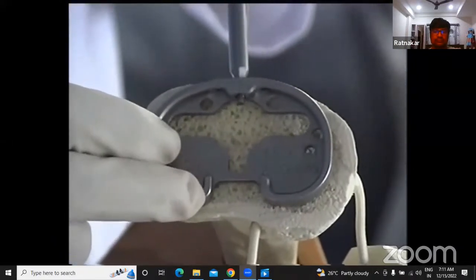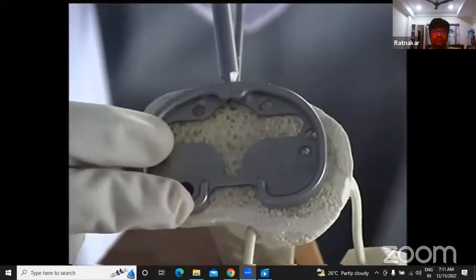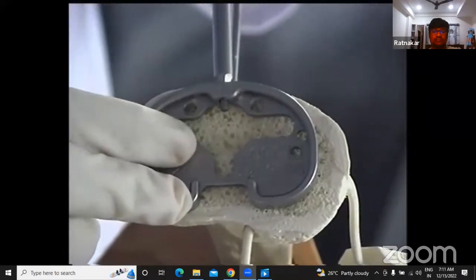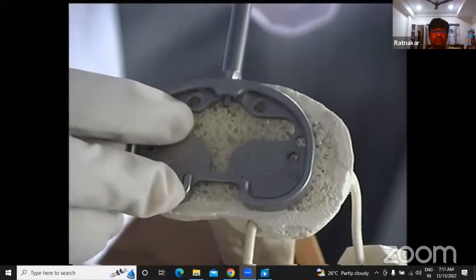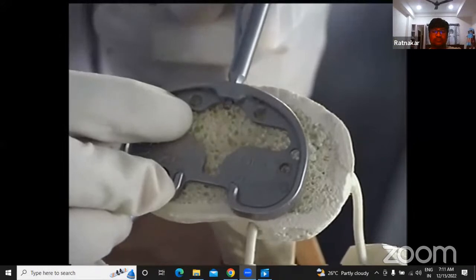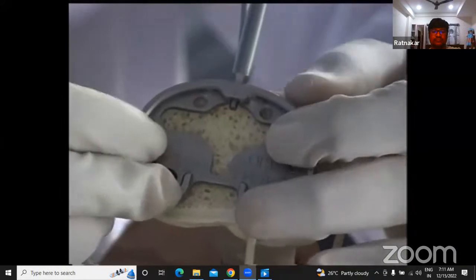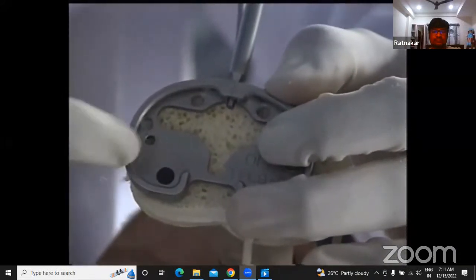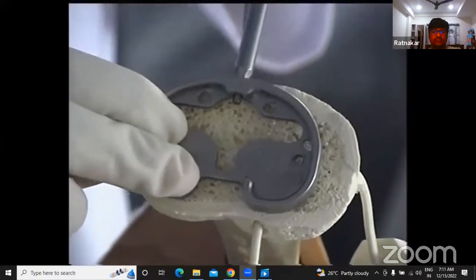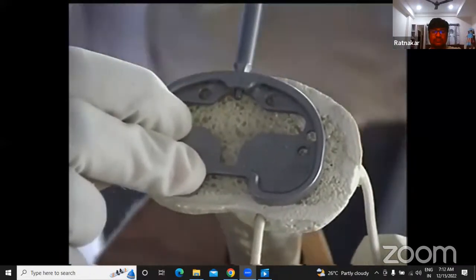Sometimes or most of the time, the tendency will be to keep this like that in external rotation because the base plate nicely sits on the tibia, but always resist that. Don't worry about the coverage. Always take one single reference point, that is the tibial tuberosity point. So if this position will have a bit of uncovering of the tibia, let it be, don't worry at all. But always see to that, that it is slightly medial to the medial third of the tibial tuberosity.